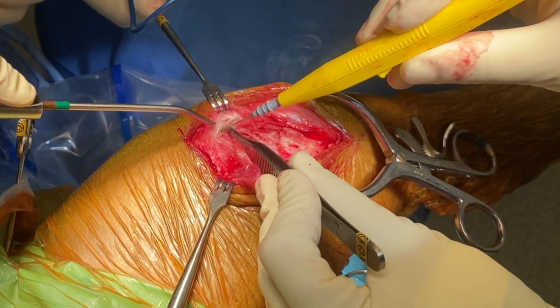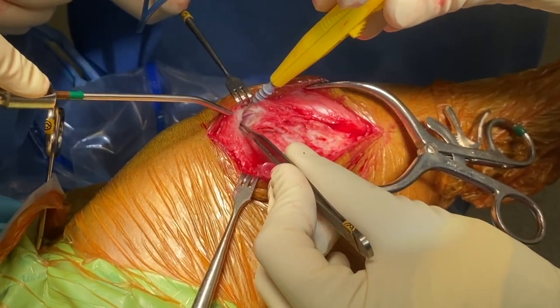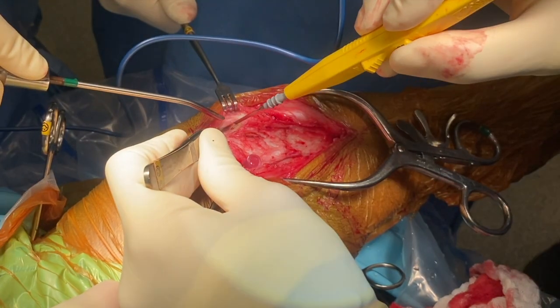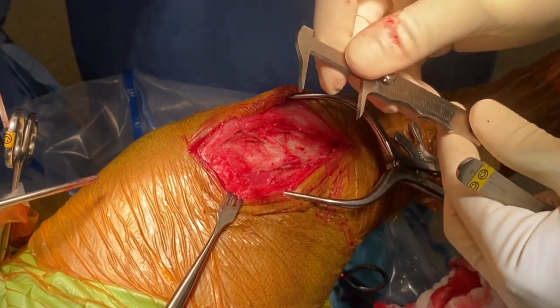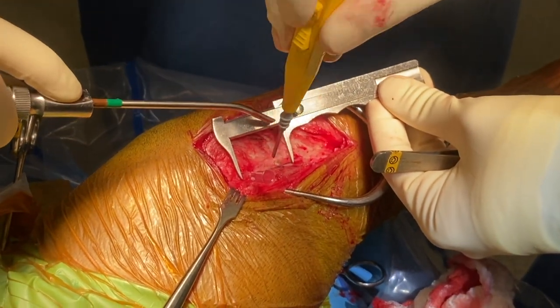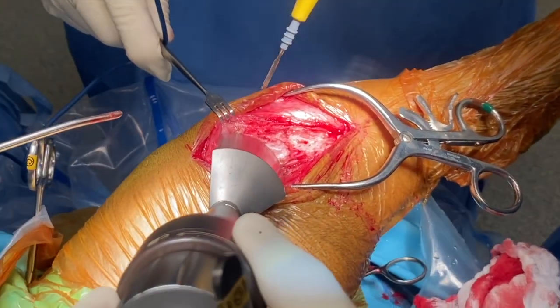The patellar tendon bursa is exposed at the insertion of the tendon and the bone is scored at the desired distance from the proximal aspect of the tibial tuberosity as determined by preoperative planning. Another marking is created across the distal aspect of the medial collateral ligament at a distance equal to the radius of the saw blade from the intraarticular needle. These markings are connected to delineate the proposed osteotomy site.